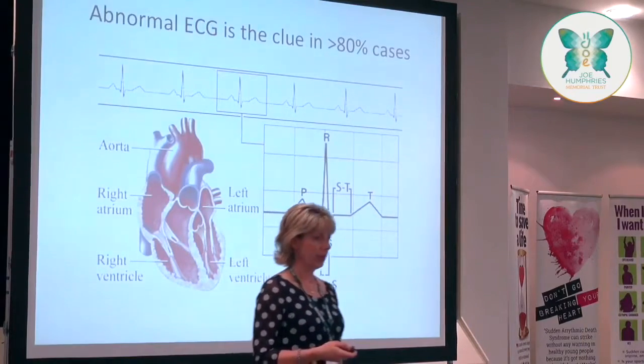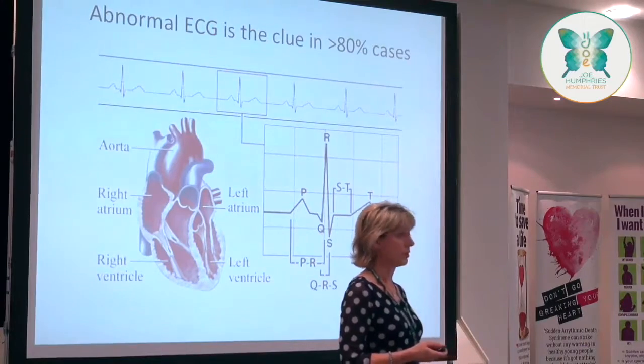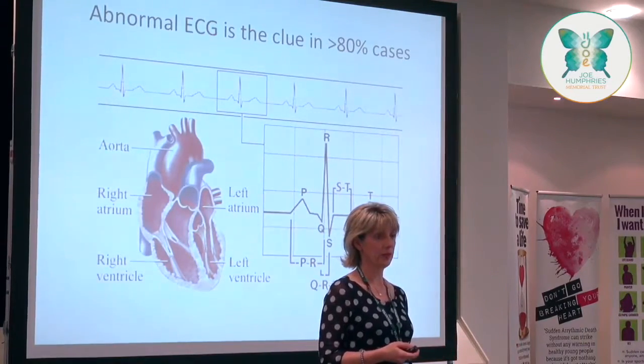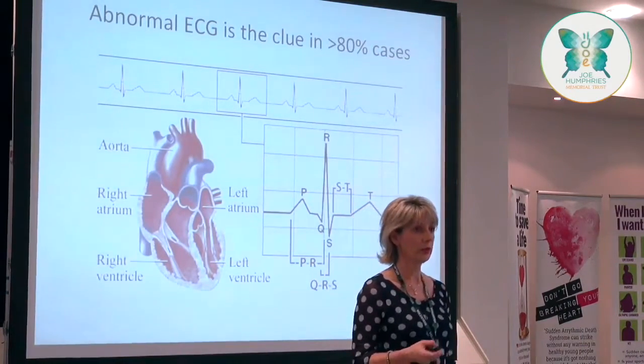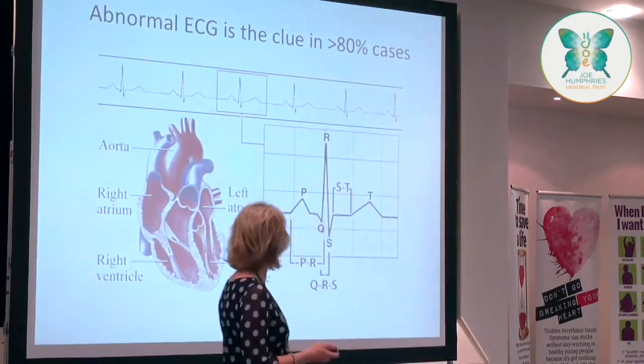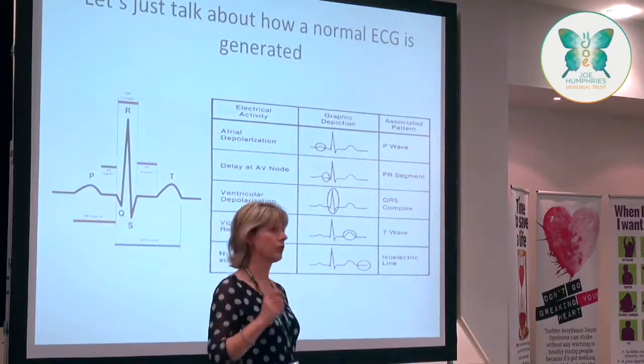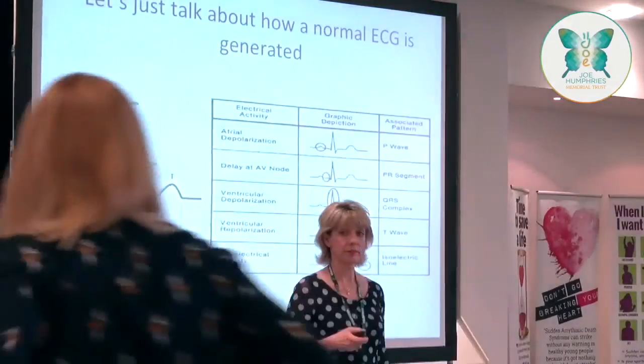And in most people, there will be an abnormal ECG, but you're going to hear from our cardiology colleagues in a moment that it's not 100% sure that your ECG will be abnormal. But at least let's do an ECG, so for the ones that are abnormal, we're going to pick things up. So I'm going to hand over to Bridget, and she's going to take you through some ECGs.